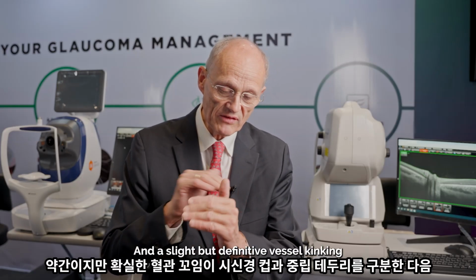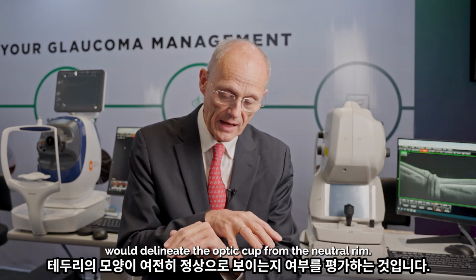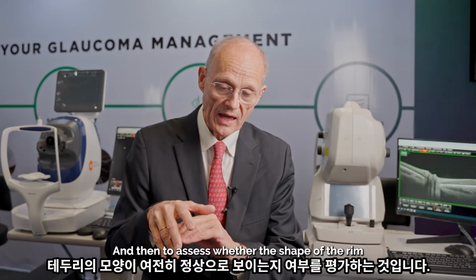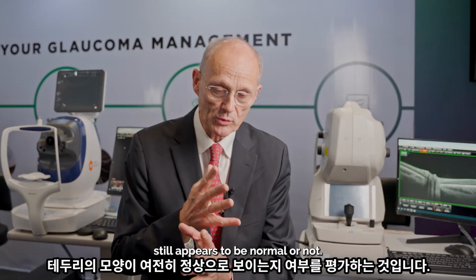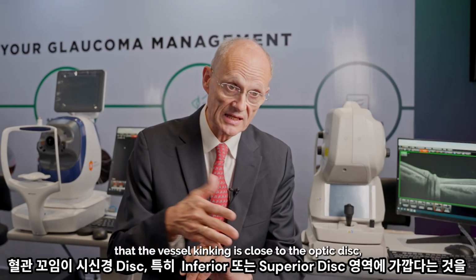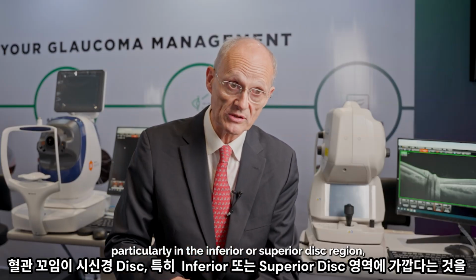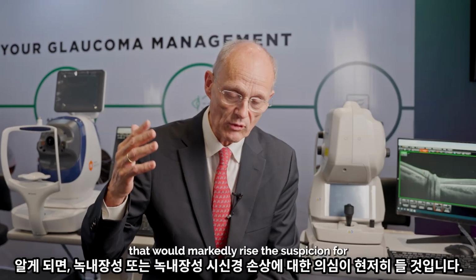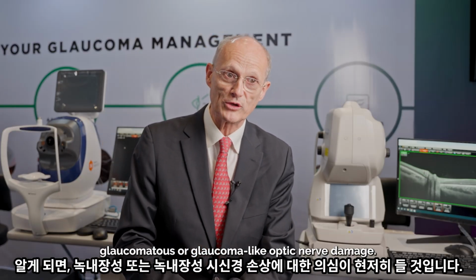And a slight but definitive vessel kinking would delineate the optic cup from the neural rim, and then to assess whether the shape of the rim still appears to be normal or not. As soon as one sees that the vessel kinking is close to the optic disc margin, particularly in the inferior or superior disc region, that would markedly raise the suspicion for glaucomatous or glaucoma-like optic nerve damage.